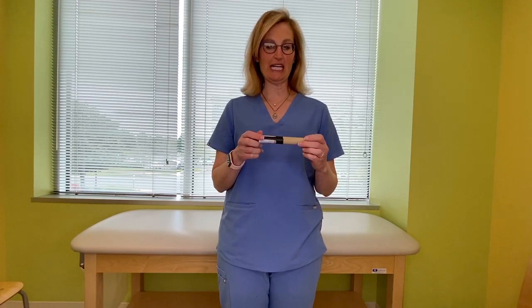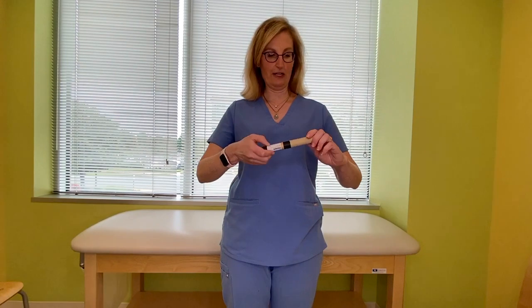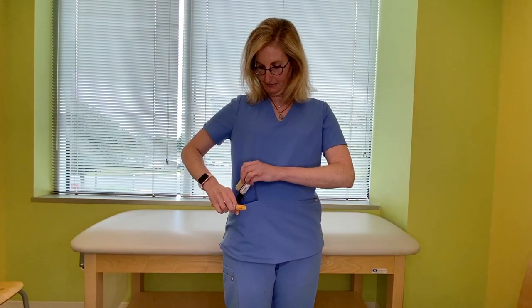There are several different types of generic injectable epinephrine pens on the market. This one is actually made by Impax, and it's a little bit different, but I'm going to show you how to use it. All you do is you open up the tube and set these aside.